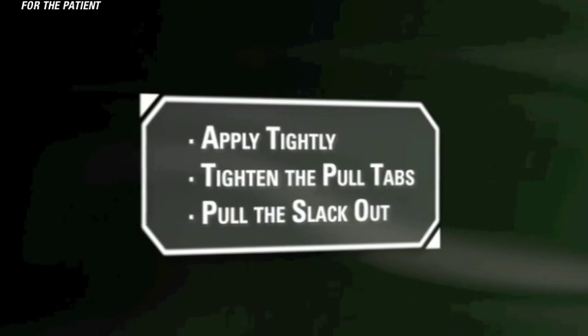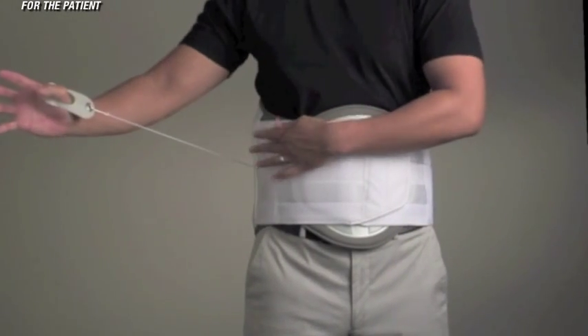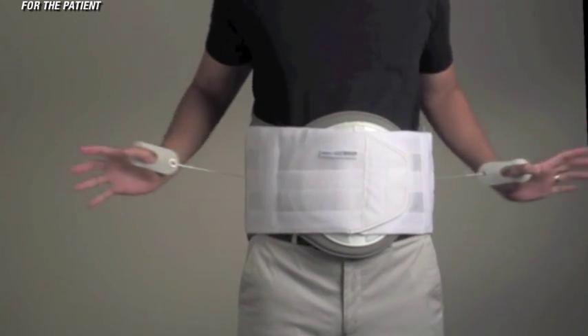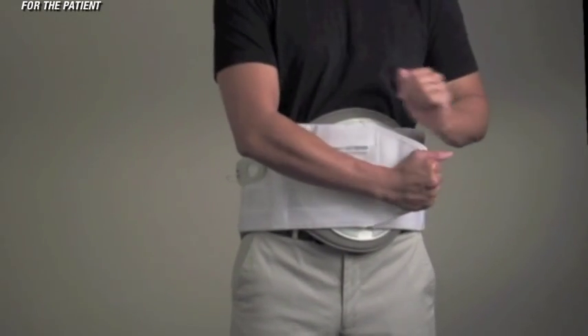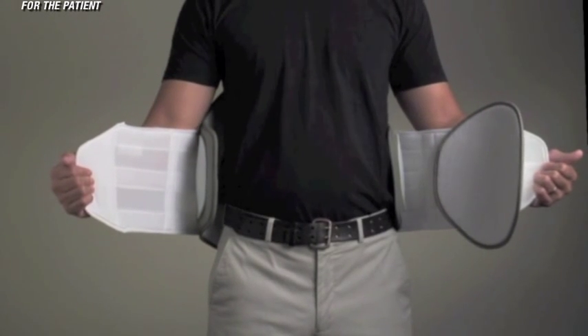When removing, pull out all slack. When you remove the brace, reposition the pull tabs towards the back of the Quickdraw, and as you disconnect the ends of the brace, make sure to pull all of the slack out. This will ensure that the Quickdraw is ready to work when you next apply it.